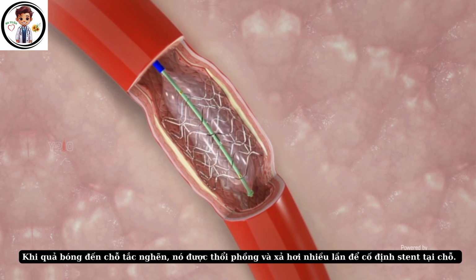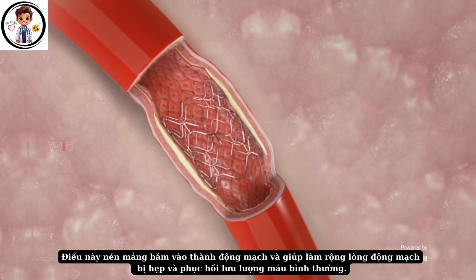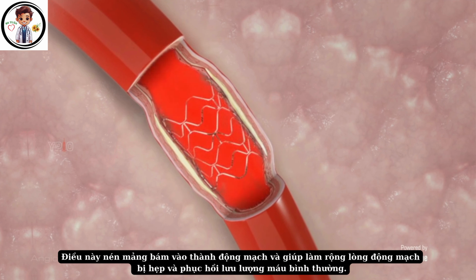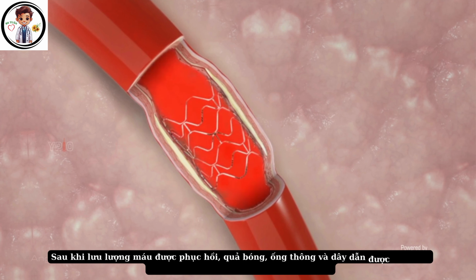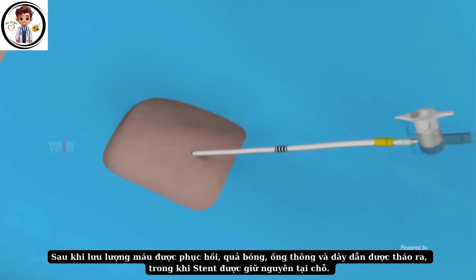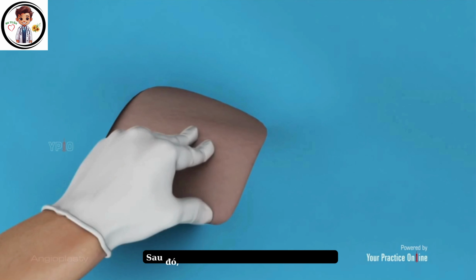stent in place. This compresses the plaque against the artery walls and helps to open up the narrowed arteries and restore normal blood flow. After the blood flow is restored, the balloon, catheter, and guide wire are removed while the stent is left in place. The incision is then closed and covered with a bandage.